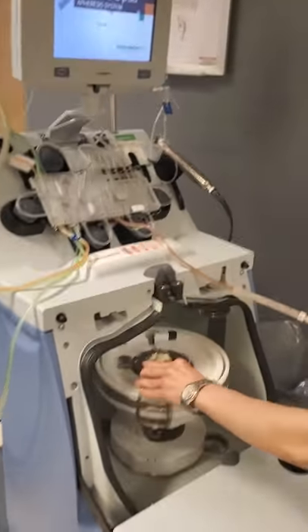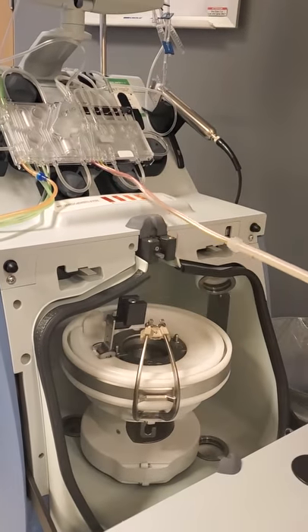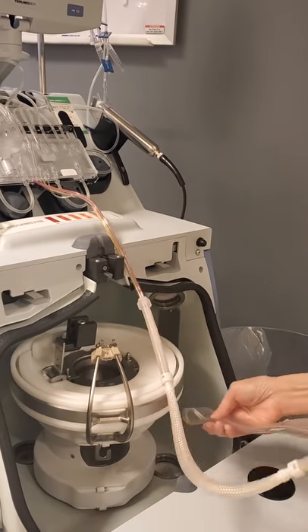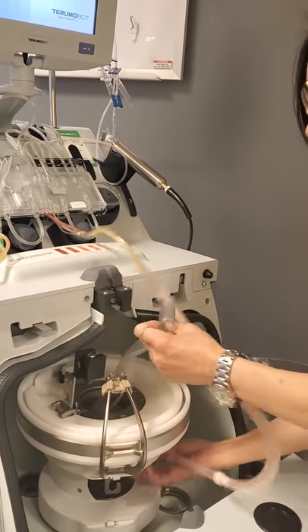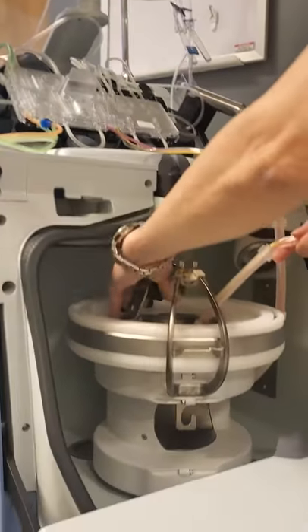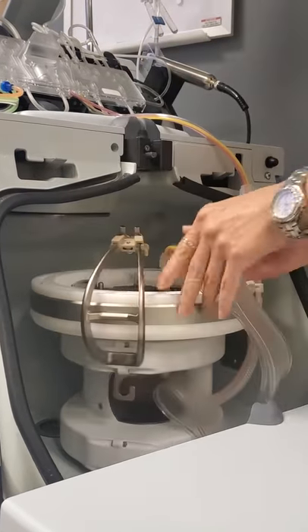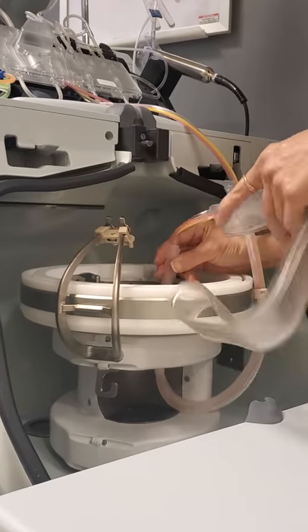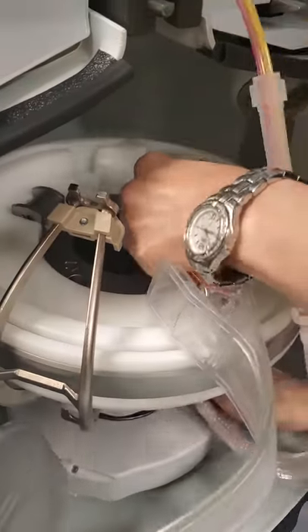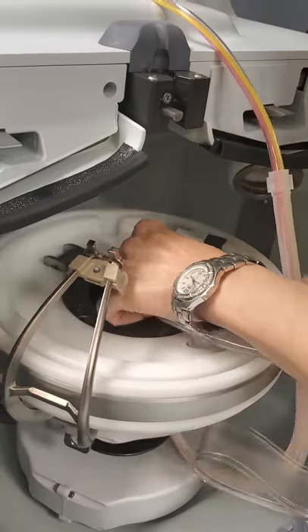Raise the filler latch first. The channel comes up through the bottom via the loading port. Then the filler latch gets lowered and locked into place. The collar sits above the lower collar holder first, and the red tube gets lined up between the two screws of the filler latch.